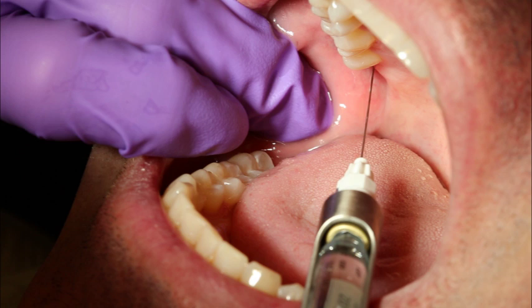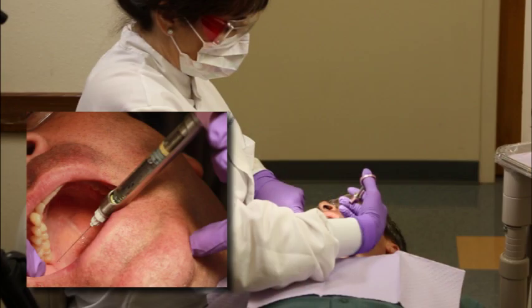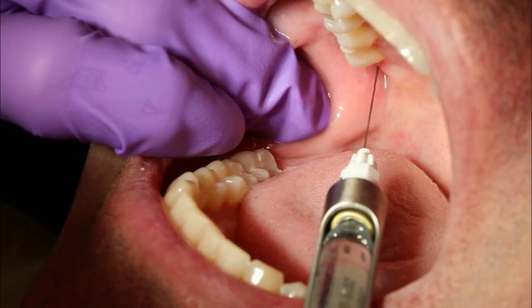Initially place the needle just inferior to the mesiolingual cusp of the maxillary second molar to determine the height for the injection. Next, place the needle distal to the maxillary second molar, maintaining the established height. Establish a fulcrum with the pinky finger of the dominant hand resting on the patient's chin. The height of insertion is superior to the mandibular occlusal plane, which is more superior than that of an IA block, approximately 10 to 25 millimeters depending on the patient's size. When a maxillary third molar is present, the site of injection is just distal to that tooth.